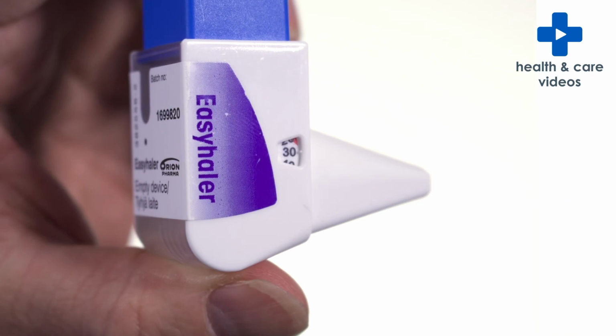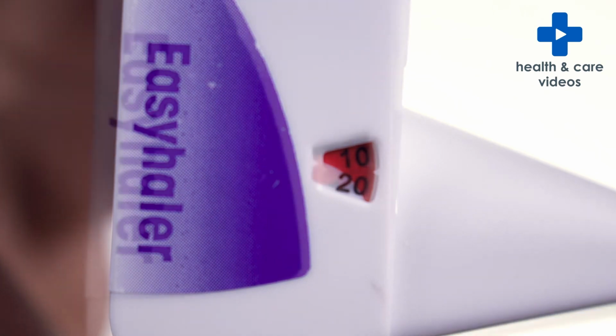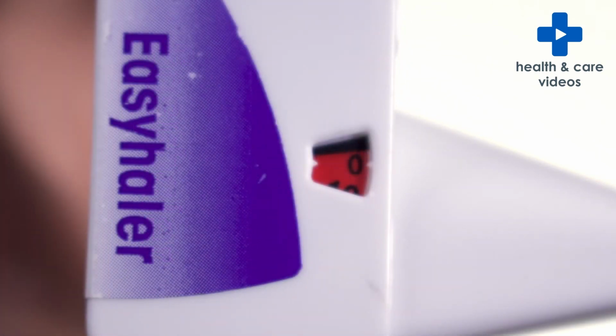The Easyhaler has a dose counter which shows how many doses are left. The counter turns after every 5th dose. When the numbers turn red, there are 20 doses left. When the counter reaches 0, you need to replace the Easyhaler, even though you can still see the powder in the clear window on the back of the Easyhaler.